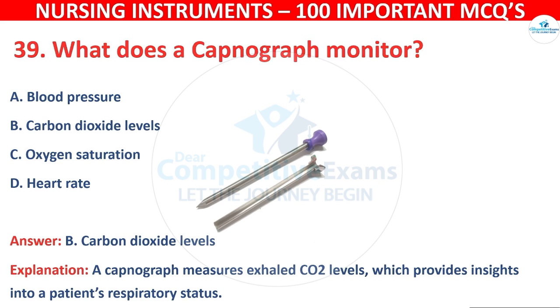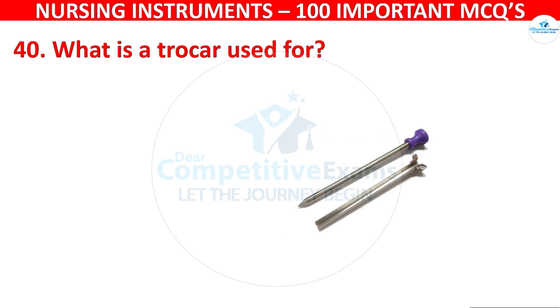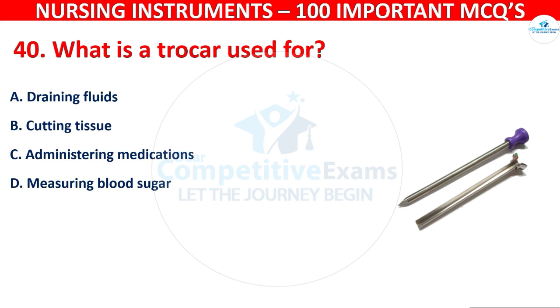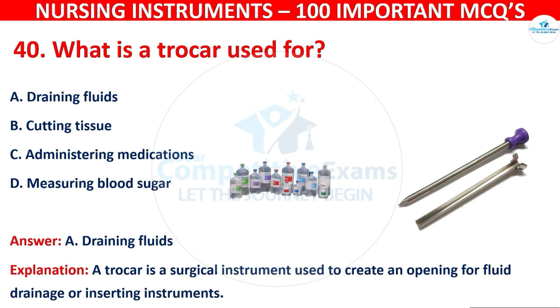Question number 40. What is a trocar used for? Your options are draining fluids, cutting tissue, administering medications, or measuring blood sugar. The correct answer is A, that is draining fluids. A trocar is a surgical instrument used to create an opening for fluid drainage or inserting instruments.